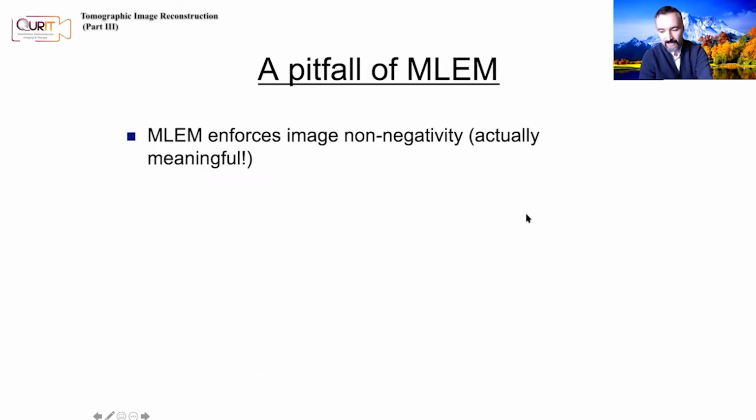The pitfall of MLEM is that, to get to that, I first have to make a statement. This is actually not a pitfall, this statement. MLEM enforces image non-negativity, meaning a reconstruction with MLEM is always going to be positive or non-negative. Now that's actually a good thing. It makes sense because you're reconstructing counts, and the radioactivity is a positive thing. Radioactivity cannot be negative. So that's a good thing.